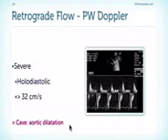One thing that you always have to be careful with is in patients who have a dilated aorta, because in those patients these values might not apply simply because the aorta is very wide and therefore the amount of blood which regurgitates spreads, and therefore the velocities might not be as high, and it also depends very much on where you place the sample volume to get these spectrums. With all this background information in mind, let's now go back to our patient and let's take a look at his retrograde flow.